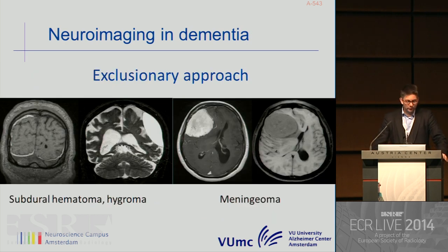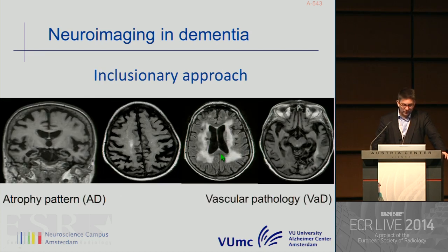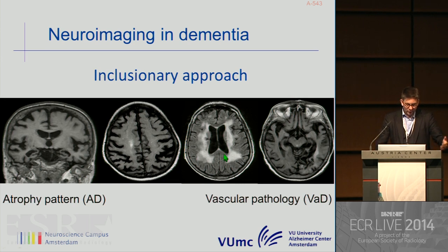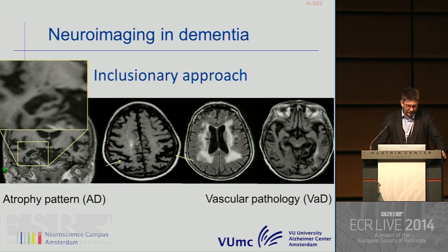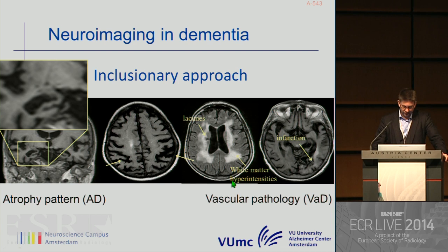This is an example of the exclusionary approach: ruling out possible treatable causes of dementia, like subdural hematomas or extra-axial tumors, as seen here in the right frontal lobe. But more often we are dealing with the inclusionary approach, by observing a certain atrophy pattern—like here in the medial temporal lobe on the right side—global cortical atrophy, atrophy of the posterior part of the brain in AD patients, and vascular pathology like lacunes and large vessel disease in vascular dementia patients.